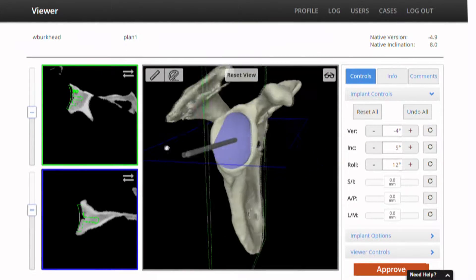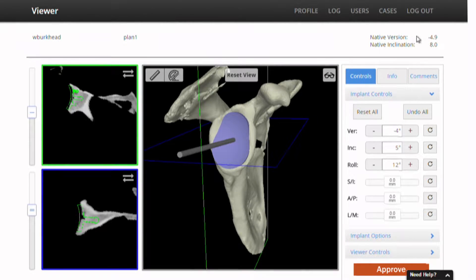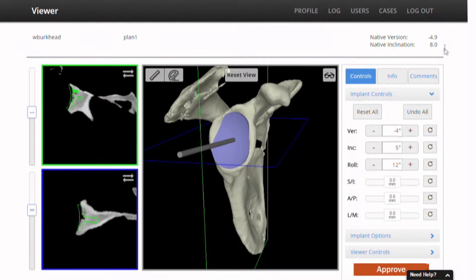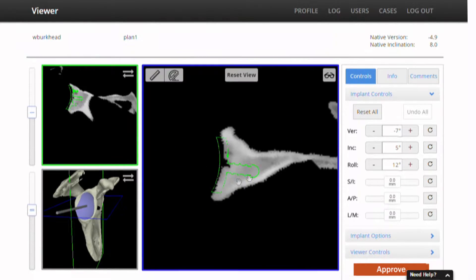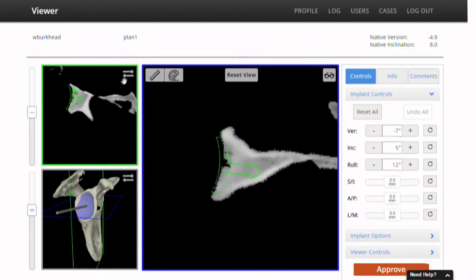The technicians have already put in this patient's native version, almost minus 5, native inclination positive 8 degrees. Looking at the version control right down here, I like maybe a little bit more retroversion in my patients, so we'll look at this screen and change the version a little bit, make it a little more retroverted to about minus 7 degrees, kind of the standard average retroversion of the human glenoid.